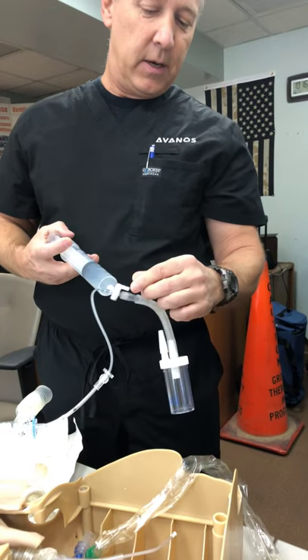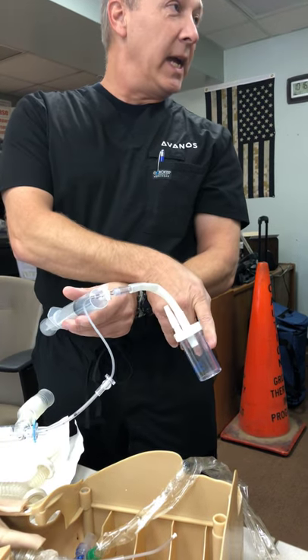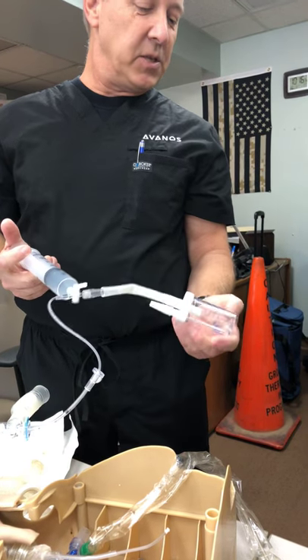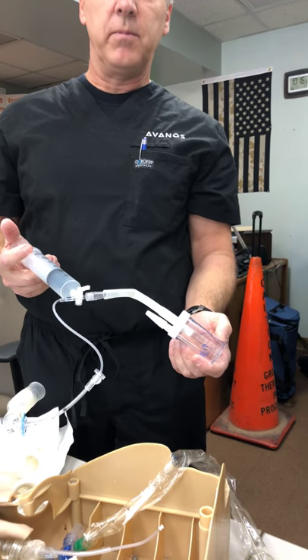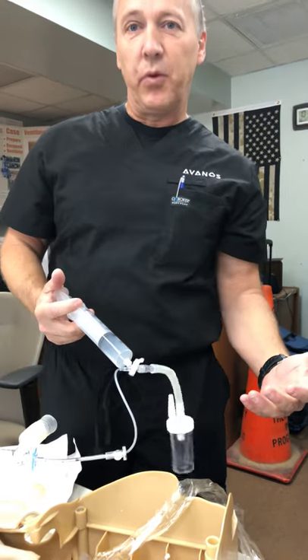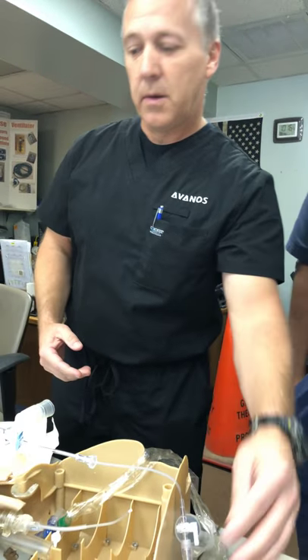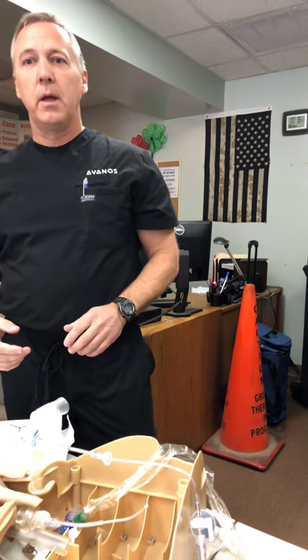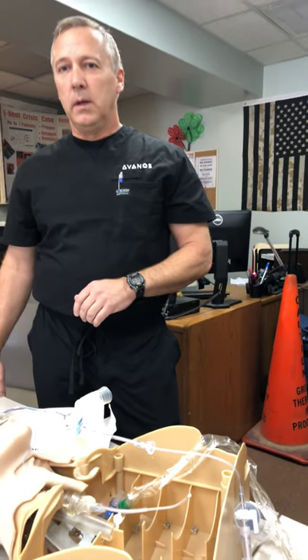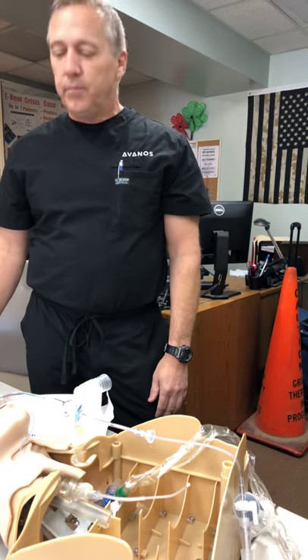20 aliquots. Then turn on wall suctioning and suction out and see what I get. If I don't get anything, I'm going to give it another 20 cc's, and then suction again. As soon as I get about five cc's, we're good. That was one of the biggest things when we did BALs in St. Louis — sometimes you would push 20 to 30 cc's in and you're not getting it all back. But then there's times you got it all back. It's just depending on how the patient's positioned.